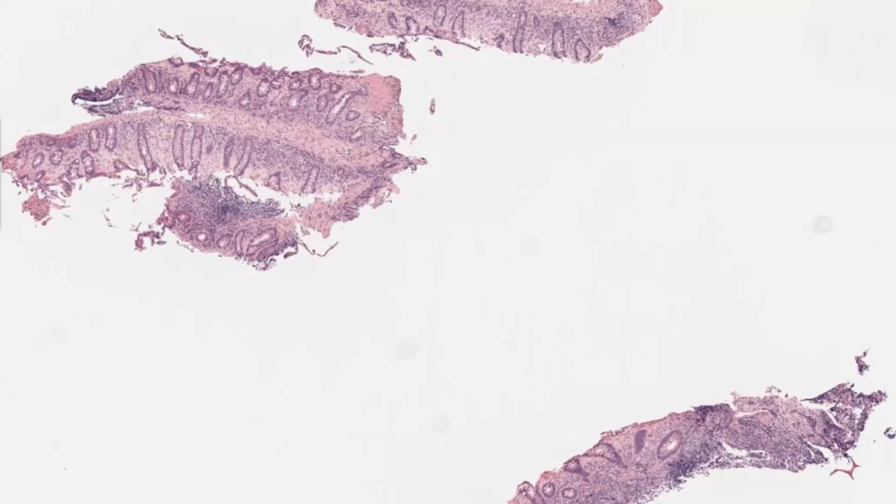So some of you said no, and some of you are now saying yes, stripped. But what about the inflammation as well? Tell me about the inflammation. Do you think that there is inflammation? Some of you said yes, stripped, but no for inflammation. Some of you maybe focal inflammation. Okay, even at this low power, I just wanted to drag your eyes to some areas. I love low power, it's one of my favorites.